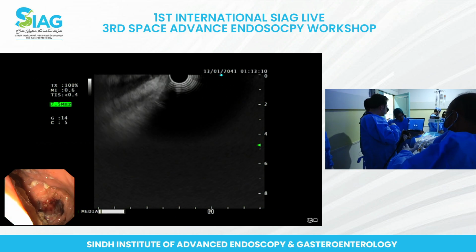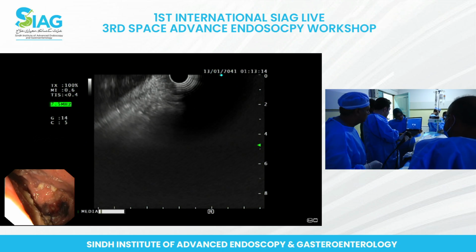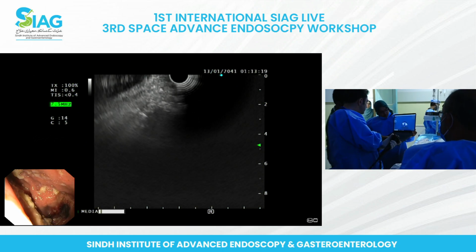Okay. Sorry, I'll just have a look at the CT scan, yeah? Is there another room ready? Can we move to another room, please? Keep on going.